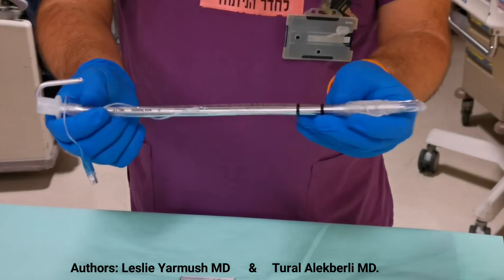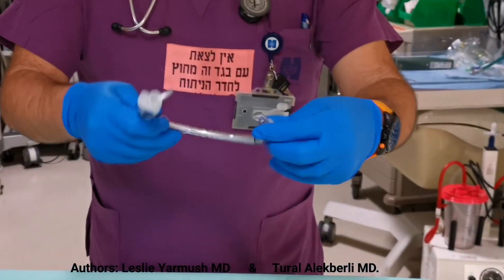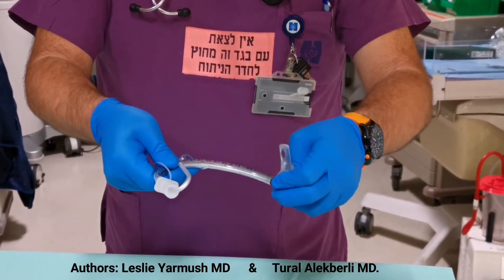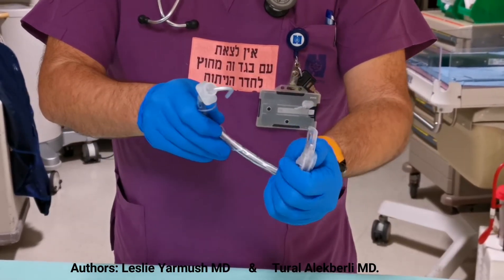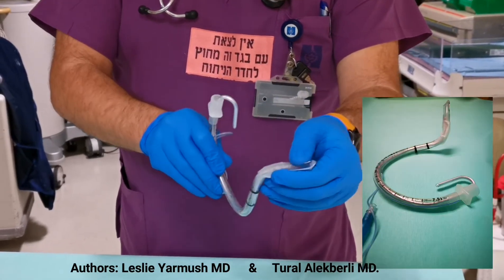Then we start shaping the tube. First, a two-dimensional C shape. After that, we give a special shape to the tip of the tube — the tip will be approximately 45 degrees medial shaped at the end. This is how it looks like.